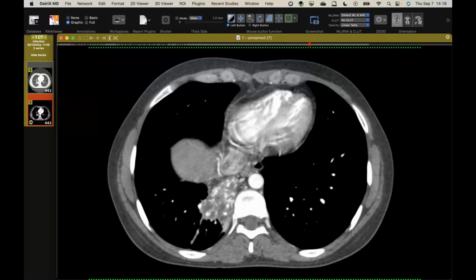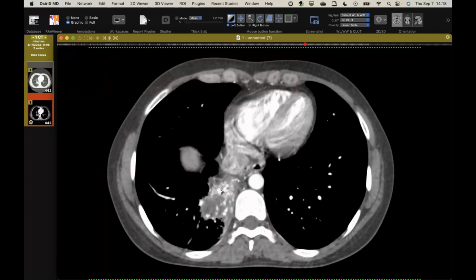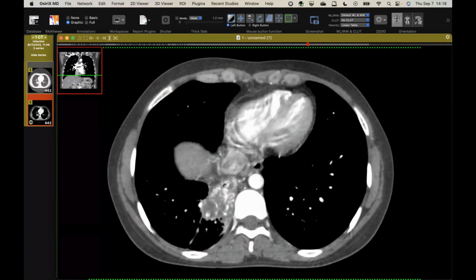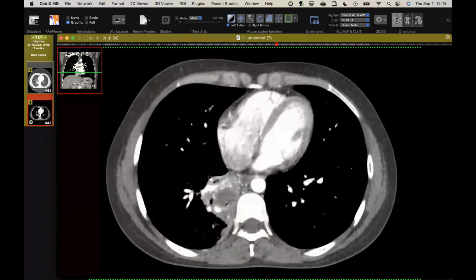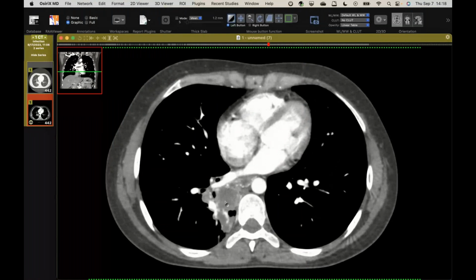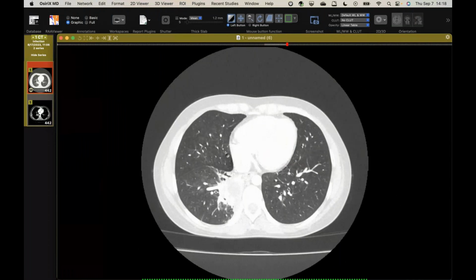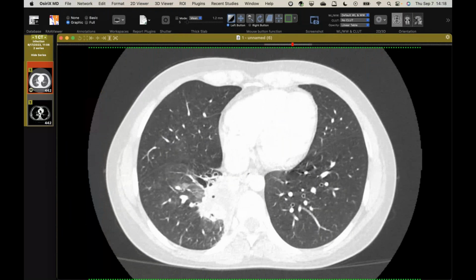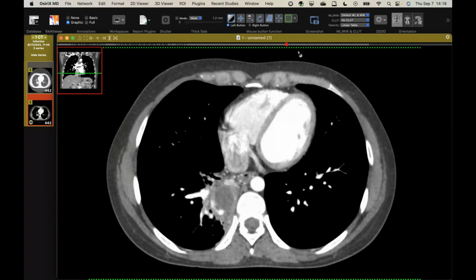It's sort of an area of chronic inflammation that is hyperemic and has parasitized the bronchial circulation and all these vessels near the diaphragm and adjacent mediastinum around this abscess here. I don't know what the bug was. It might even be tuberculosis. Who knows? But would you all agree this is a pseudo sequestration? Yeah, this is some beautiful case. Let me make a point: was the patient's condition subacute or somewhat chronic, rather than an acute respiratory illness? It is not an acute presentation at all. This has been going on for some time.